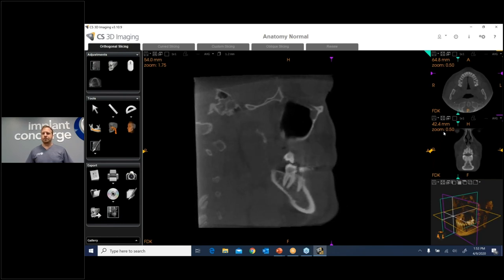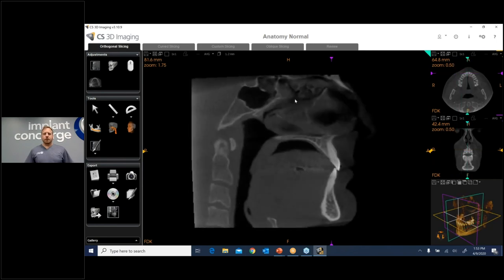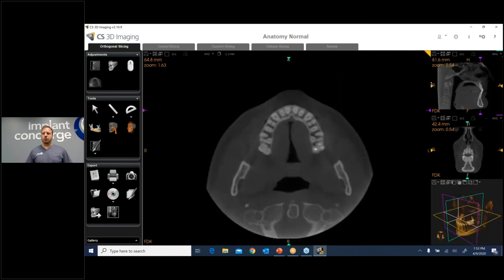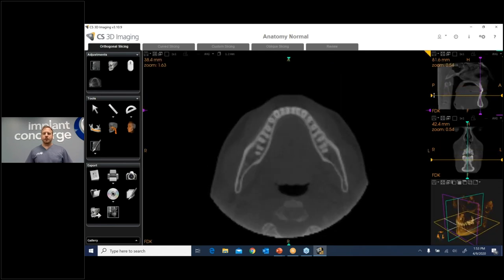Airway in the mid-sagittal view — lingual tonsils will be located here. Even though the tongue isn't in an ideal position, you can see there are no enlargements. This is where your adenoids are — your pharyngeal tonsils. Going to the axial, you're looking for the area where you'd see your palatine tonsils. You don't see any convexity here, which is where you'd have them. Nothing going on with the tonsils — this patient's airway is very patent.